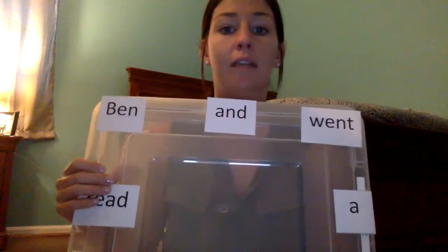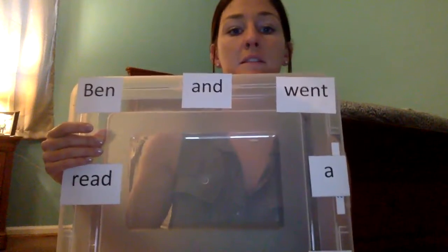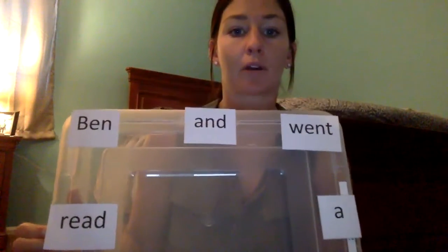Adding the plus coordinates and the X coordinates together creates a larger grid of responses. Where we started with a 4-word sentence, it can now be an 8-word sentence, such as this one: Ben went to school and read a book. Similarly, any other lesson can be progressed from simple to more complex. The board can keep morphing into further education that is going on for him.